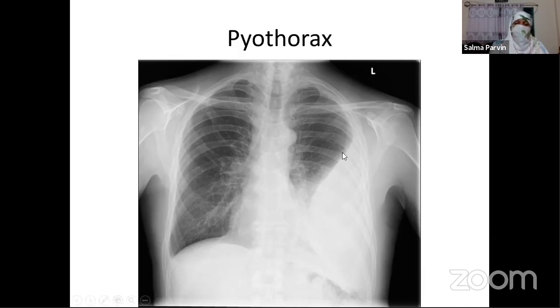We get it also in ultrasound. The next day I will describe what a benign ultrasound looks like. In a clean-cut benign effusion on ultrasound, we get just moving fluid in the chest, and in cases of pyothorax, we will get numerous running septa and increased internal echoes in the fluid space, which denotes the presence of excessive cellular tissue in the pleural fluid.